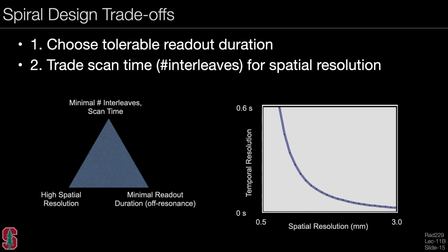Notice that we could repeat this design by holding the scan time constant or holding the spatial resolution constant and trading off between the other two parameters. So we'll see an example of this shortly.